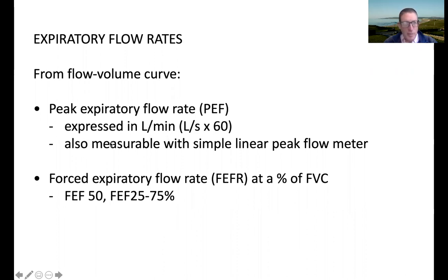Now, we don't give patients a spirometer to use at home. We give them a simple linear peak flow meter, which is calibrated to measure the peak expiratory flow rate, which costs a few pounds and is prescribable. So that's where the peak flow rate comes from.